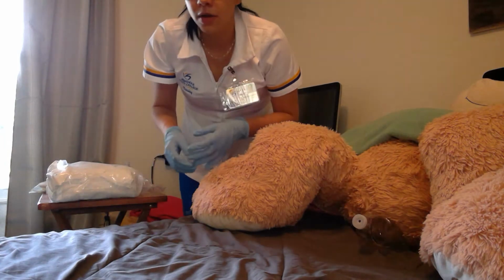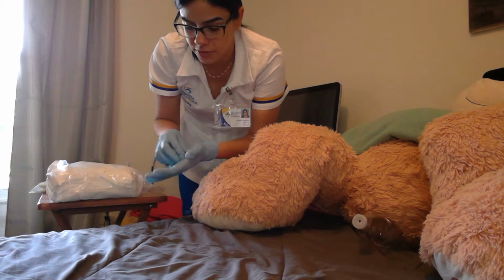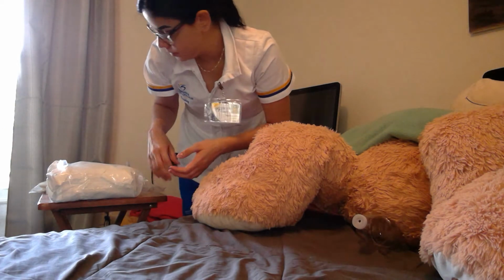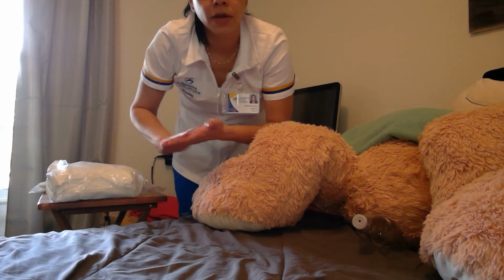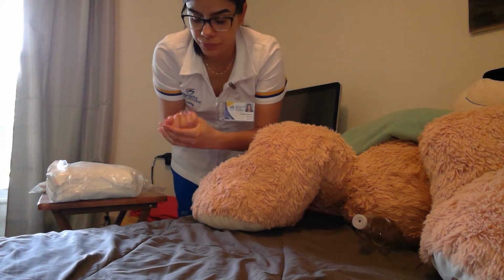Okay, hospitals usually have linen bags where you can dispose of that stuff. Gloves off in the trash can, and hand hygiene. Now that we've done that, we are ready to do our procedure.